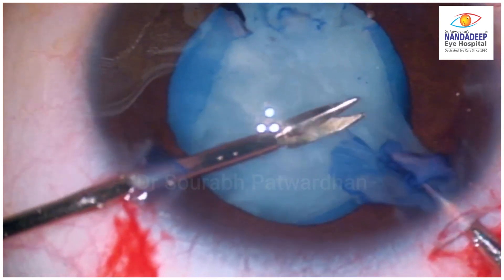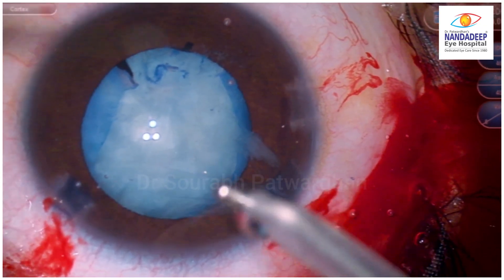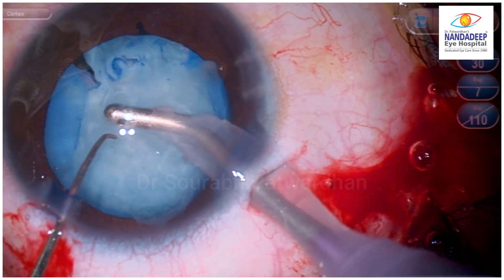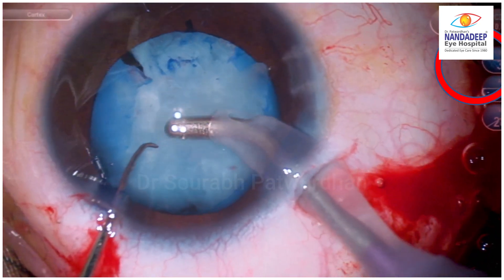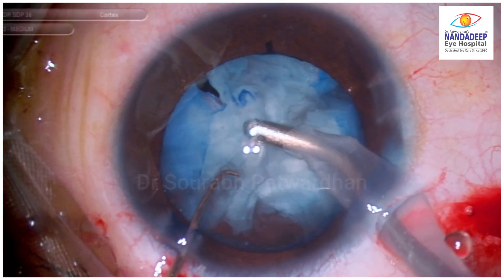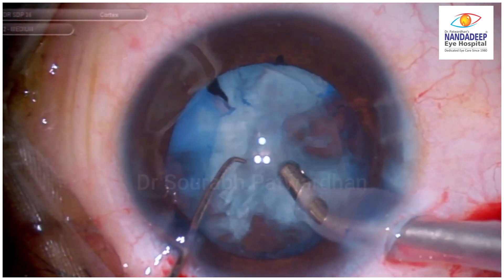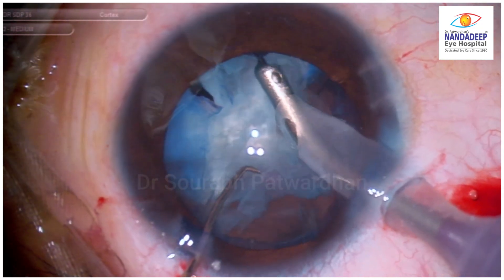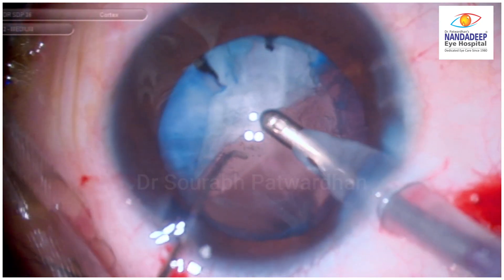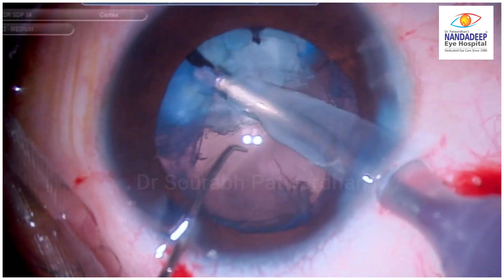In cases of traumatic cataracts where the injury is by thorn or wire, there can be a pre-existing PC tear. Here I used the low IOP function with active fluidics of Centurion — I have kept the IOP at just 30 mmHg. As I entered the IA probe there was no deepening of the anterior chamber, and that's the advantage of using low IOP. If there was a PC tear, it may not open because we are using low IOP, and if the anterior vitreous face is intact it may just stay intact.